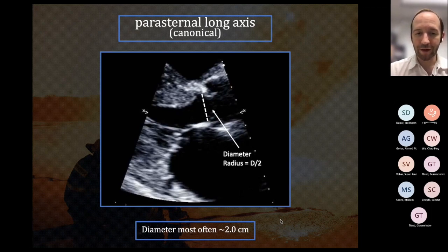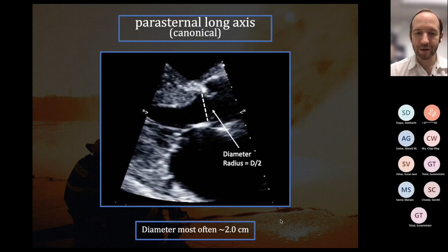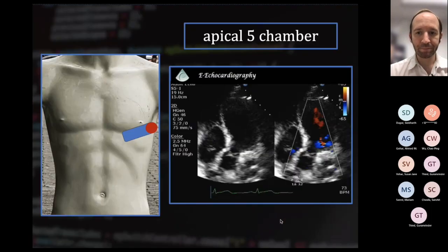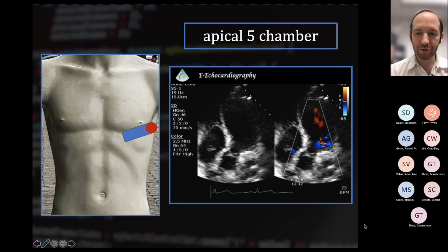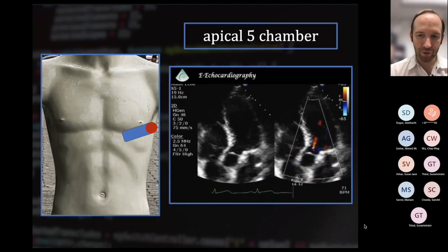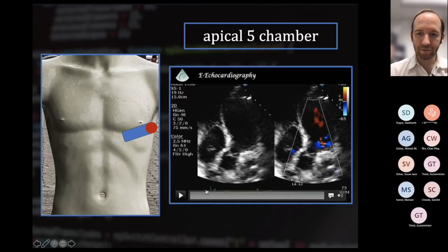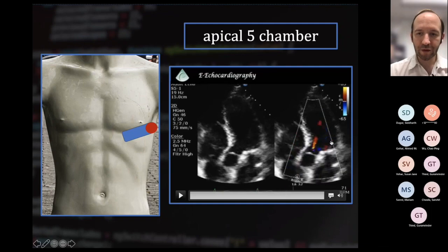Knowing the normal values for LVOT VTI will largely obviate the need for these calculations. As you're doing serial VTI measurements, you don't need to continue to measure the LVOT diameter, because that is relatively fixed. Next, move down to your apical four-chamber position, drop the probe angle down a little bit, and obtain an apical five-chamber view. I like to use color Doppler here, because you can see a nice laminar blue jet moving away from the probe out of the LVOT — that tells me I'm in the right position to obtain an acceptable LVOT VTI jet.